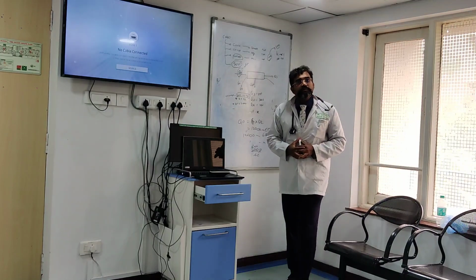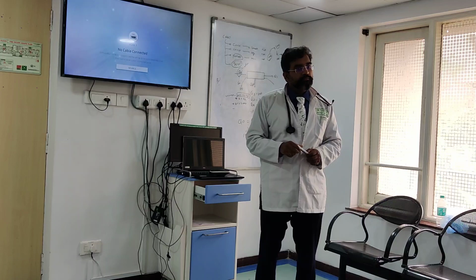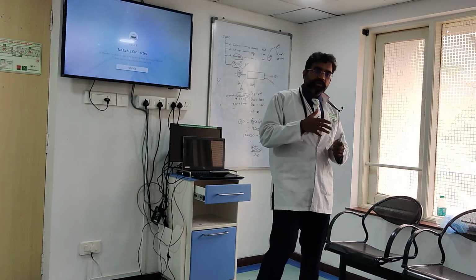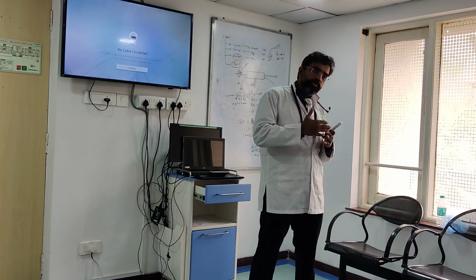समझ में आ रहा है? सचिन, समझ में आया तेरे को? Clear? But ये केस सिनेरियो में hemofiltration how it is working? Dialysis, I got it. So convection also clears small and middle molecules. So small molecules भी निकलता है.